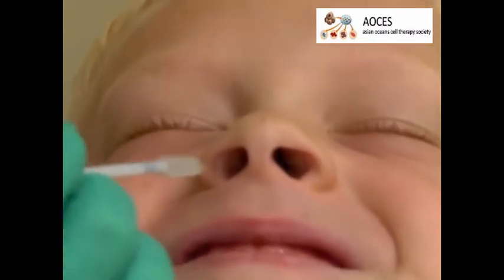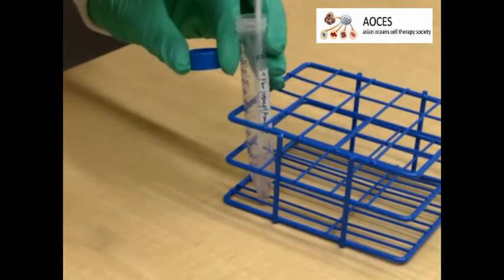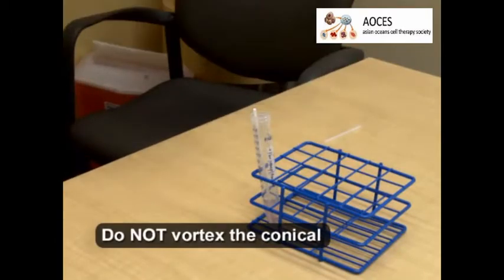Afterwards, remove the brush from the nostril by sliding it down with a twisting motion of the wrist. Continue by placing the brush in the previously prepared conical tube and ensure that it is submerged in BEGM. Then, cut off the excess portion of the brush and fasten the cap on the tube.